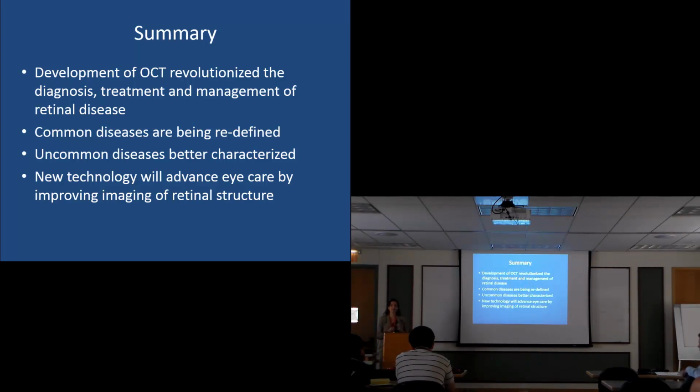Now for glaucoma, this is really interesting, because they tend not to use the morphology of the eye, they really look at numbers. And there, it's nicely color-coded. Green, the patient's safe; red, the patient's not safe, you should start drops. So are we being accurate with that? And can we get that into retina? That would be cool. Now, I'm so focused on retina, but there's glaucoma, optic nerve diseases, and other things. There's so much possibility of refining this for looking at other diseases besides just retina too. Did that answer your question too?